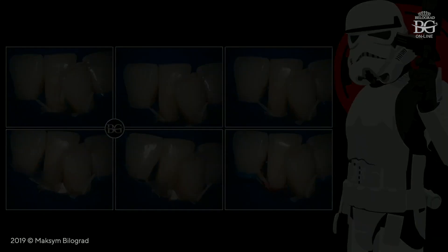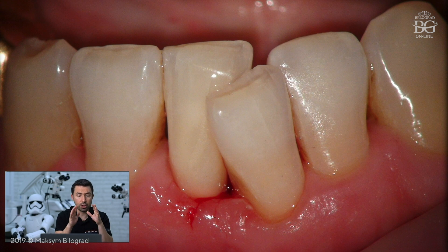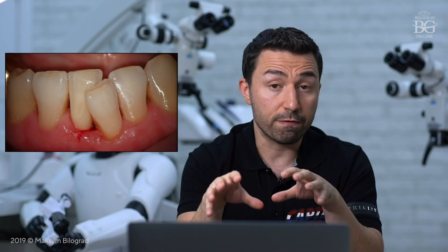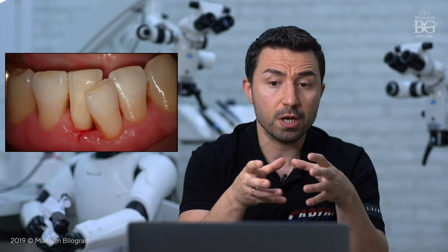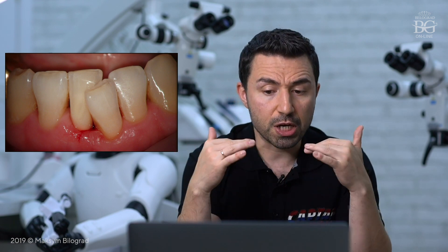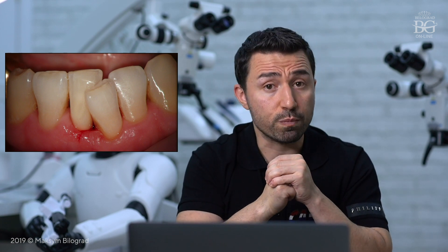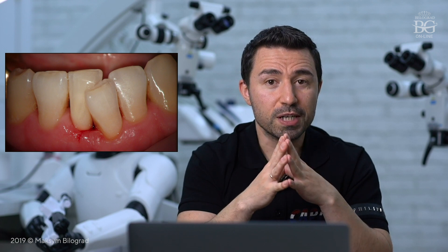This is a tip you can use in certain clinical cases. After some stripping and polishing we got a really smooth emergent profile. In summary: we chose minimally invasive treatment as the core approach; we made an extremely conservative defect-oriented access; we selected proper instruments for curved canal conditions; we used a heavy rubber dam with floss ties for tissue retraction; and we used the injection molded technique to create a smooth emergent profile without being able to place a wedge.